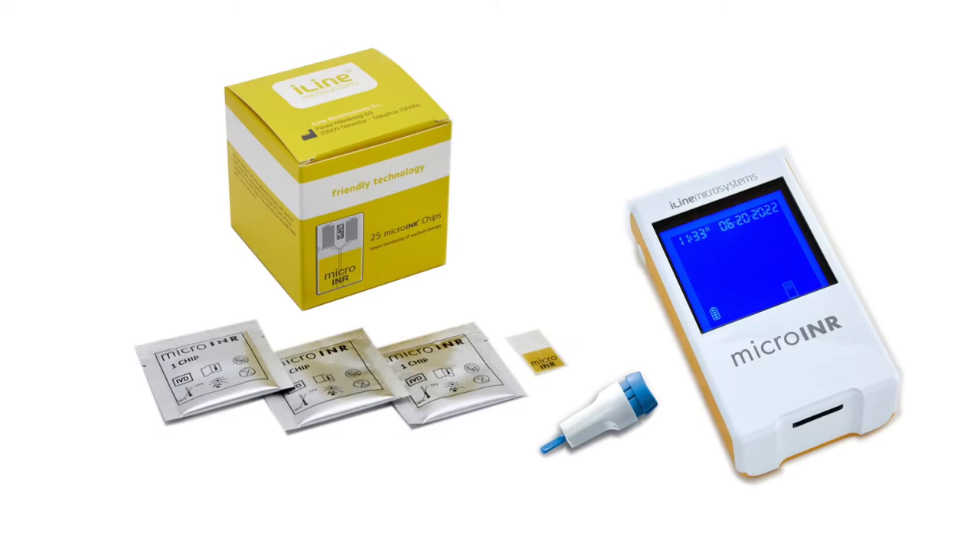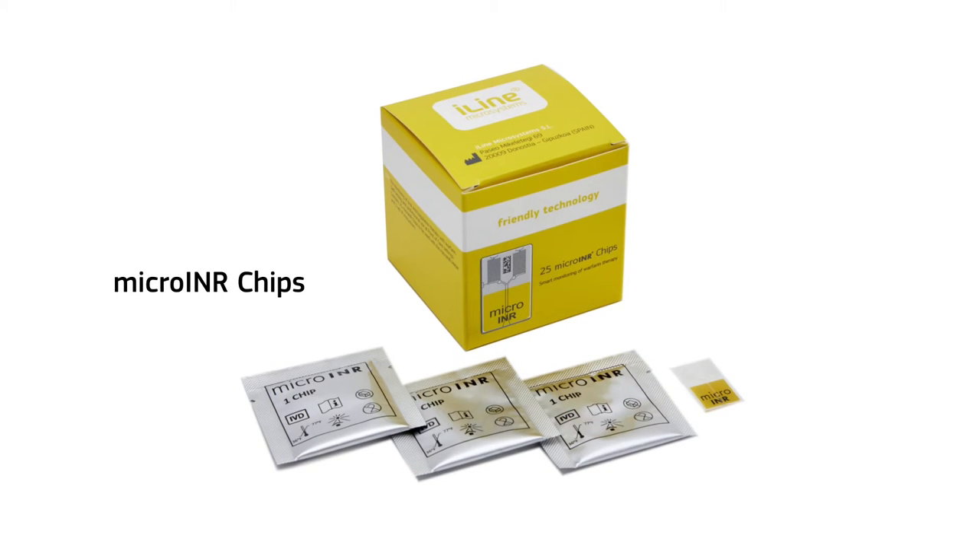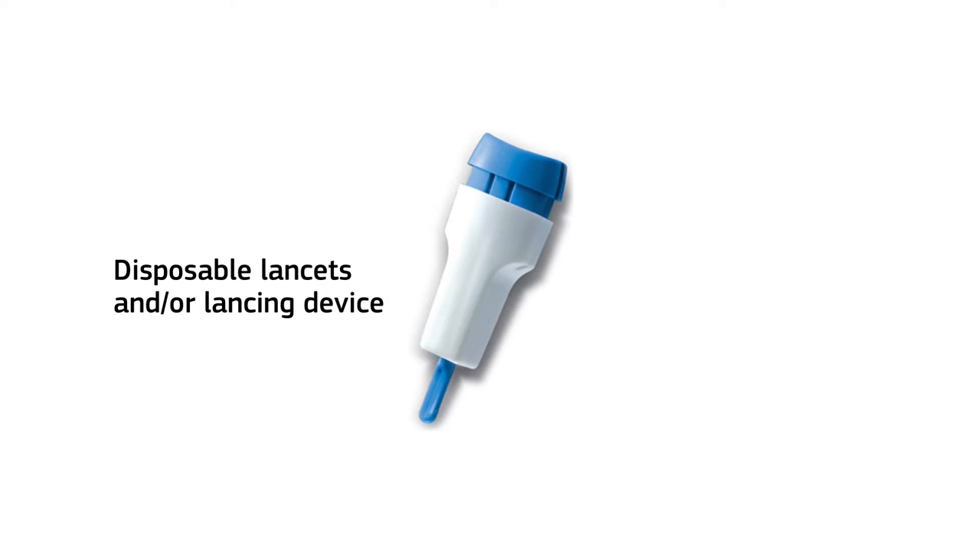Have the following items ready before you start: the Micro-INR meter, which must be placed on a flat and steady surface; Micro-INR chips; disposable lancets; and/or a lancing device.